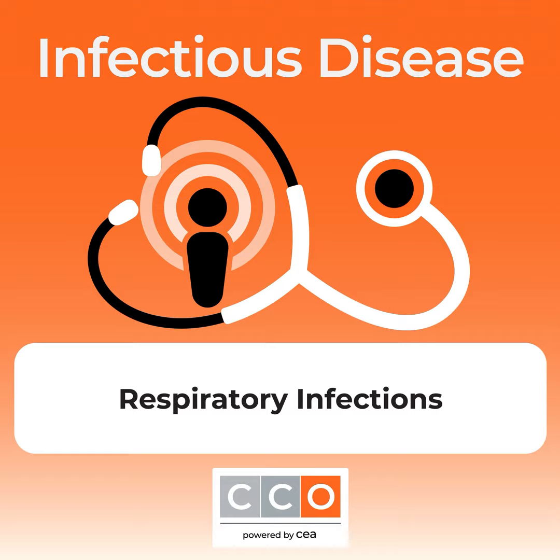It detects the same atypical bacteria. It detects antibiotic resistance genes, including genes that confer resistance to carbapenems in Acinetobacter, such as OXA-23. And also importantly, it detects an important fungus, Pneumocystis jirovecii, which of course is an important cause of pneumonia in immunocompromised patients. So some differences here.